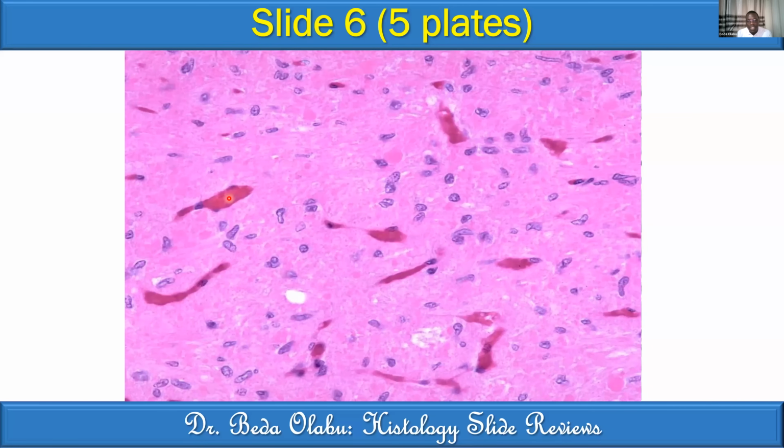One, it is richly vascularized. Two, it contains some cells. Now the cells it contains, the ones we're seeing their cell bodies, don't be tempted to call them cell bodies of neurons, because remember, if this is neurohypophysis, then those nuclei cannot be the nuclei of neuronal cell bodies. Remember, the cell bodies of the neurons in neurohypophysis are located in the hypothalamus. They are not in the pituitary.